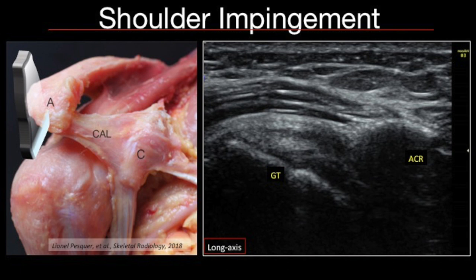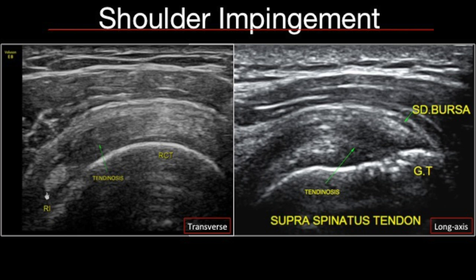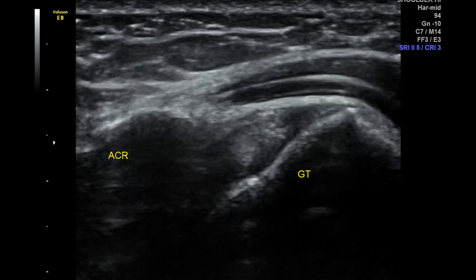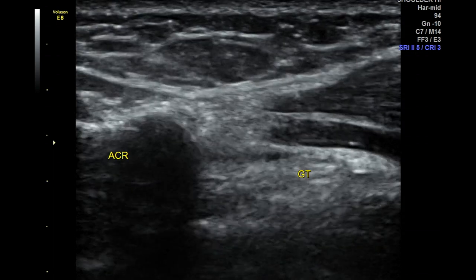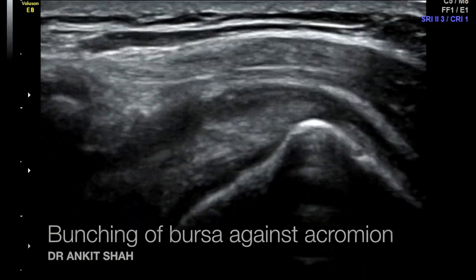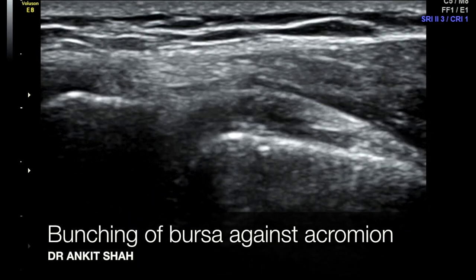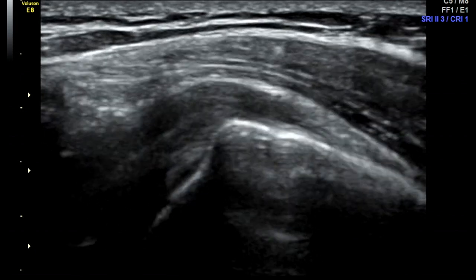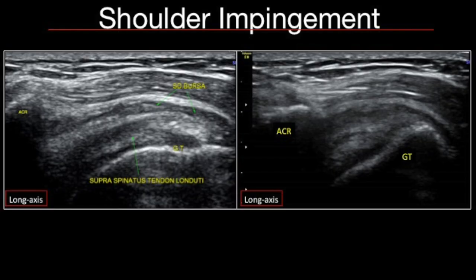Mind you, this is a clinical diagnosis. The primary signs are interrupted gliding of the supraspinatus tendon below the acromion, or bunching of the tendon or subacromial subdeltoid bursa along the lateral edge of the acromion. For the dynamic maneuver, place the probe along the lateral edge of the acromion and ask the patient to do abduction of the arm. The secondary signs include tendinosis of the rotator cuff, a thickened bursa, or effusion within the subacromial subdeltoid bursa.